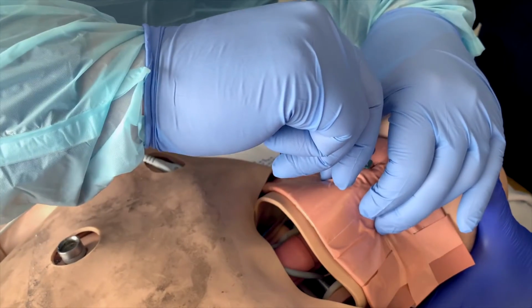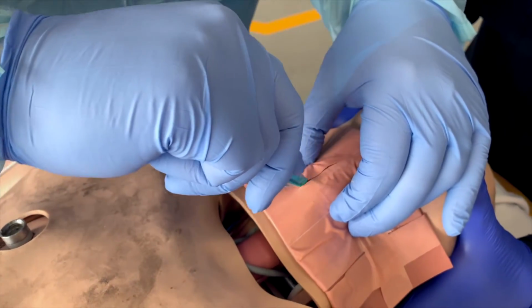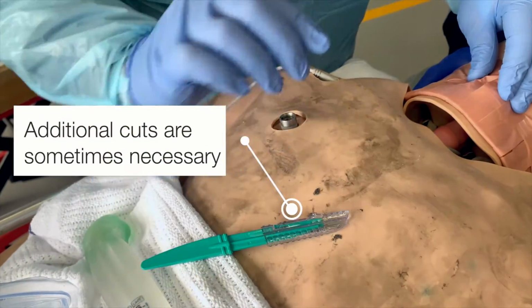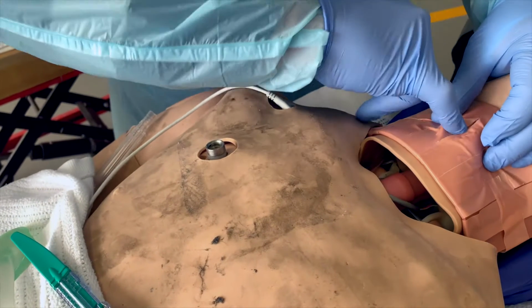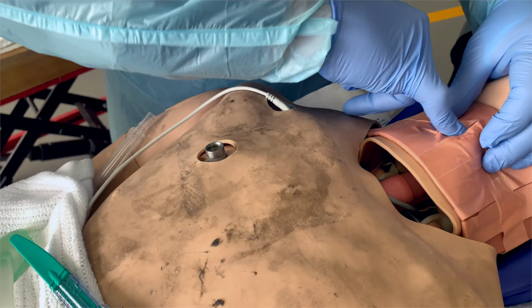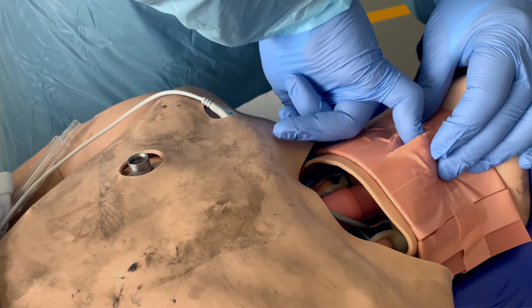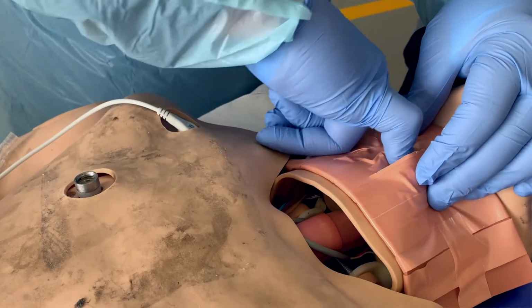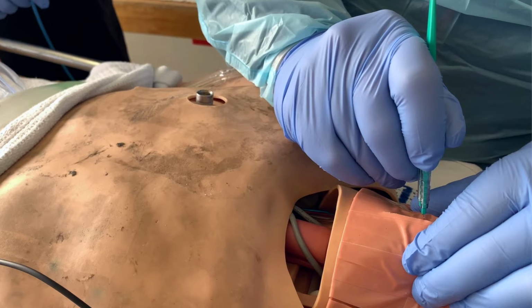A longer incision may be required if the underlying anatomy is not easily identified, such as the bariatric patient. It's important to ensure sharp safety at this point and not to dispose of the scalpel prematurely. Again, using your non-dominant hand, spread the skin apart to assist identification of the airway structures, feeling for the membrane with the scalpel hand. Having identified the cricothyroid membrane, either visually or by touch in the event of excessive blood, cut to air with a horizontal incision through the membrane.